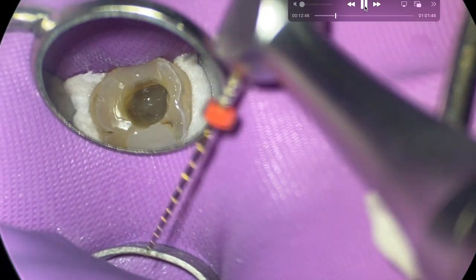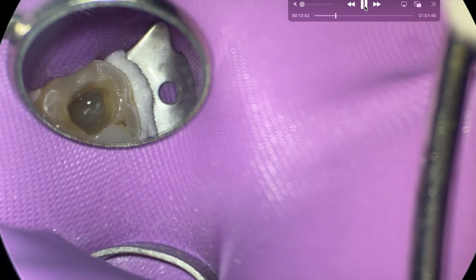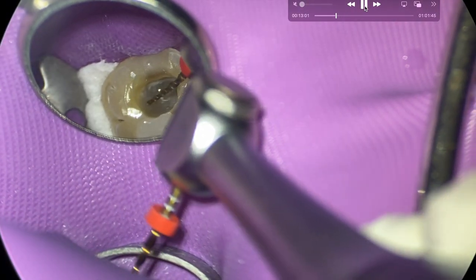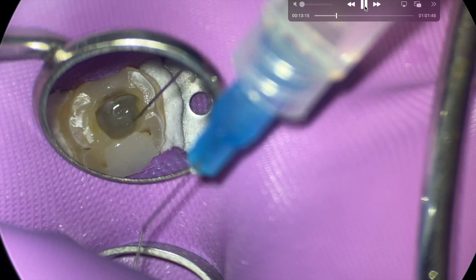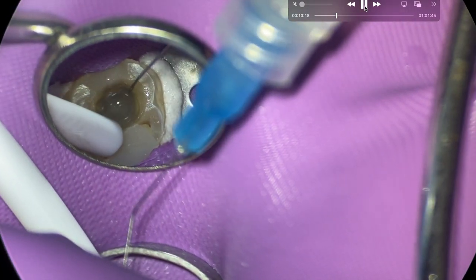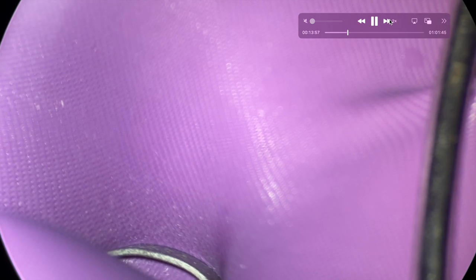See how the cuts are flat? That's very helpful because your reference point will be stable every single time. In terms of efficiency and tackling these cases, we're going to clean and shape. We have working length of all of our canals, the three main canals. It's easy to get really focused on trying to get down MB2. What I'm going to do is I know that I have working length on all of these. I need sodium hypochlorite to get down there to break down vital tissue or kill bacteria. We're going to clean and shape and get those ready for obturation and let them sit and soak in sodium hypochlorite for the rest of the entire appointment.